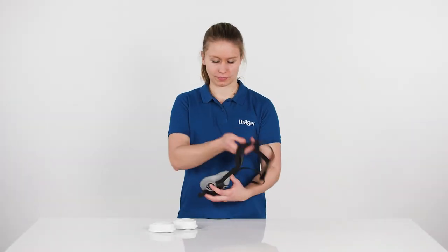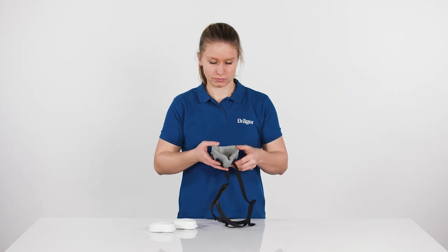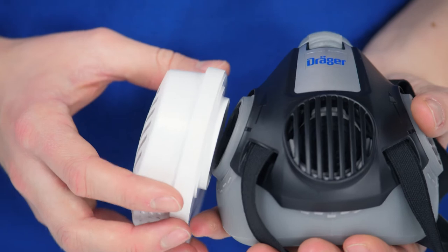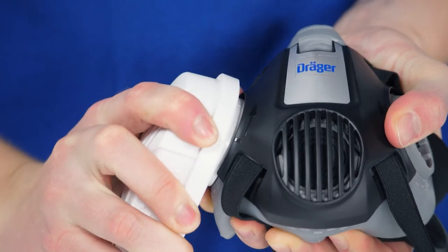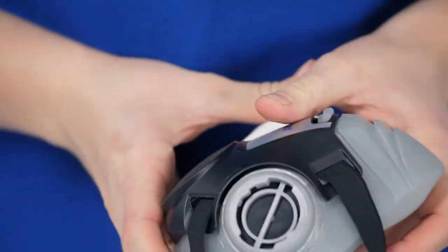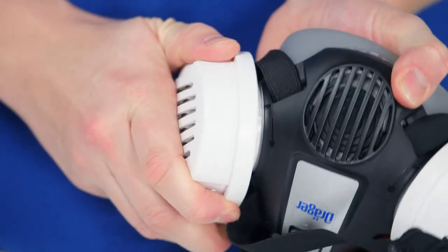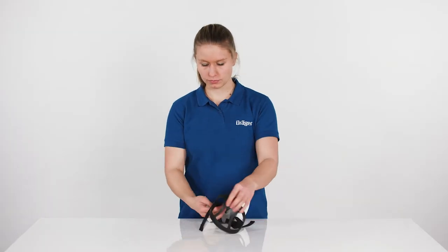Before donning, perform a visual inspection of the mask. Then position two respiratory filters, ensuring that the line markings on filters and mask line up. Insert the filters in the direction of the arrow until they lock into place by twisting each respiratory filter downwards until a stop is felt.